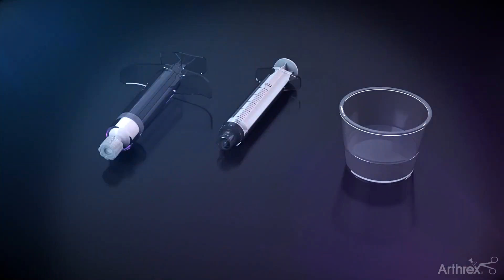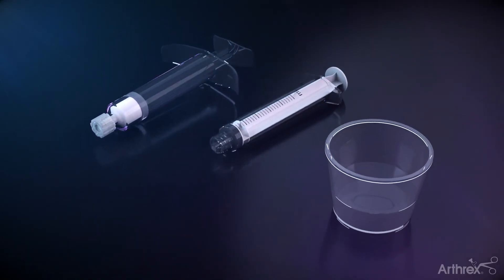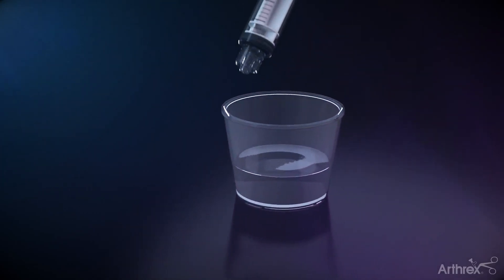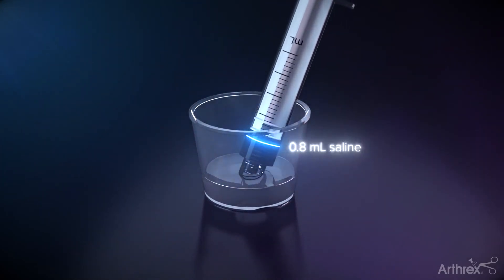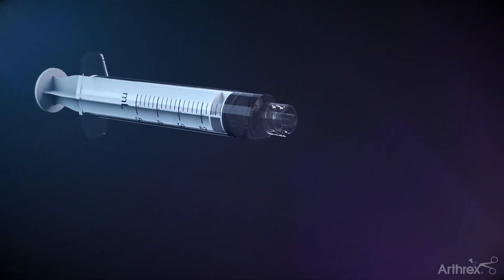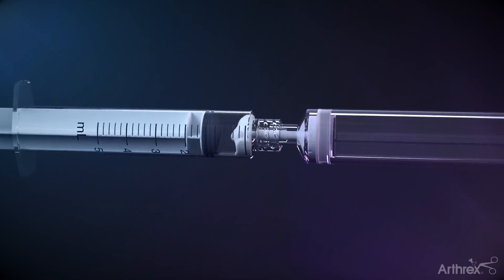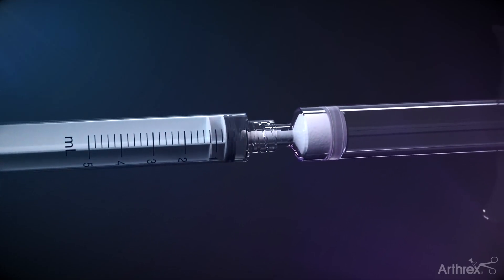When additional support to the surrounding poor quality bone is needed, Bone Sync Cement uses a mixing protocol that quickly results in an easily injectable cement. Draw 0.8 milliliters of saline into a syringe. Remove the clear cap of the Bone Sync Powder Syringe and thread the two syringes. Inject the saline into the Bone Sync Powder Syringe and mix thoroughly for 60 seconds.